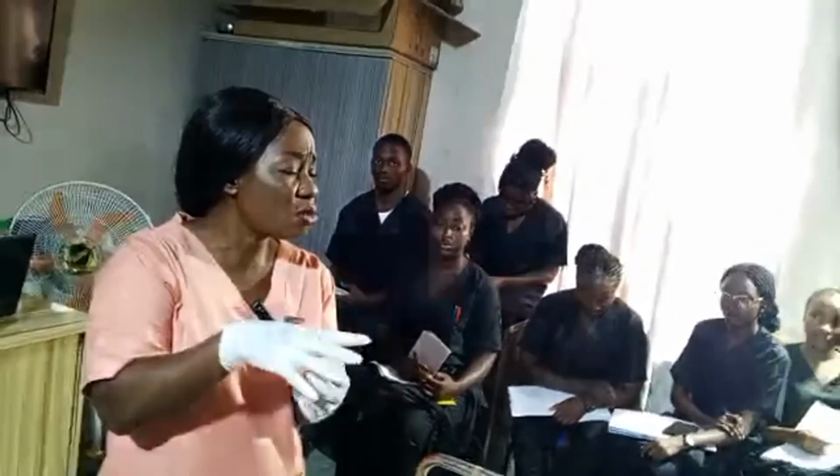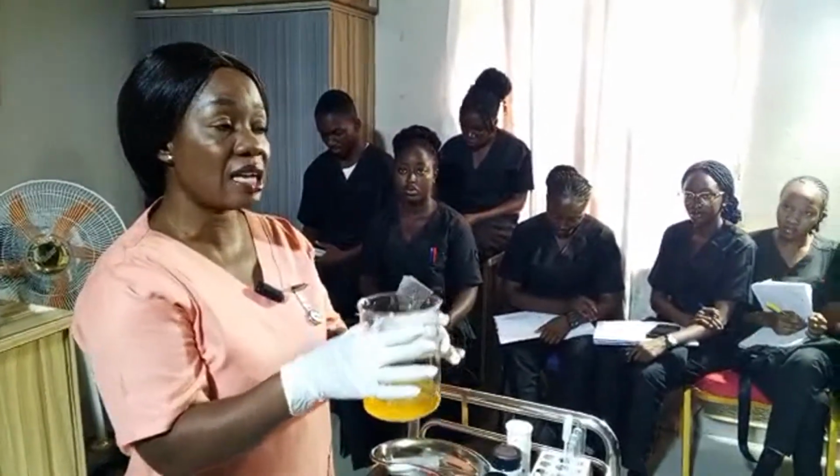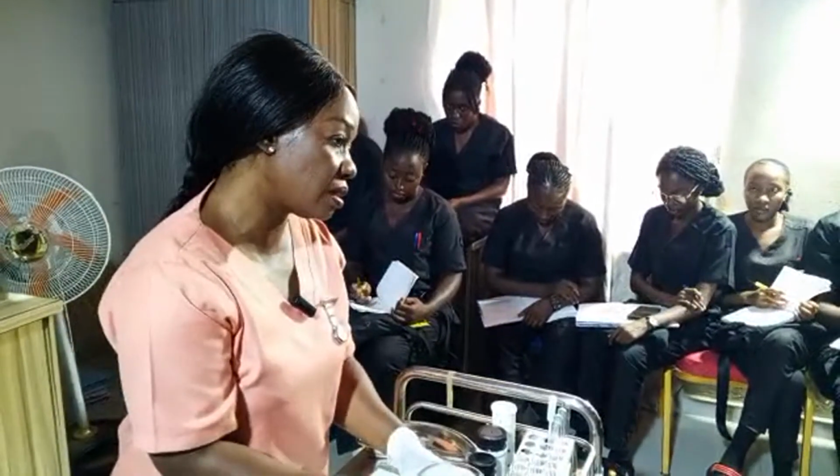Definitely my urine will be highly concentrated. Do you notice sometimes you will see the urine is somehow deep, brownish. So that color, because the person is dehydrated. But for this urine, the person is not dehydrated, so it's amber in color, right?